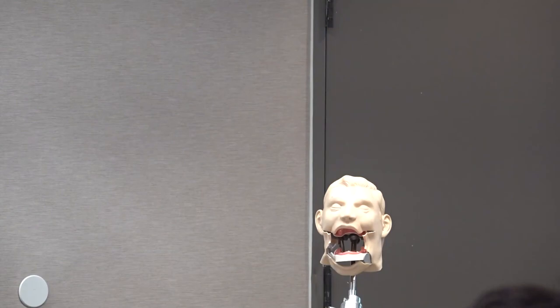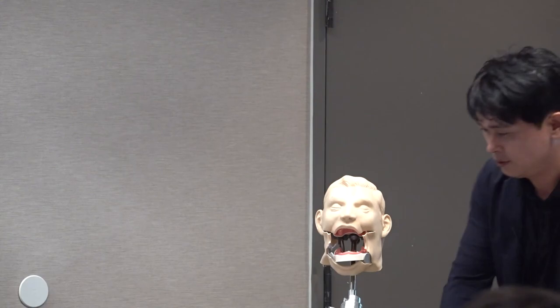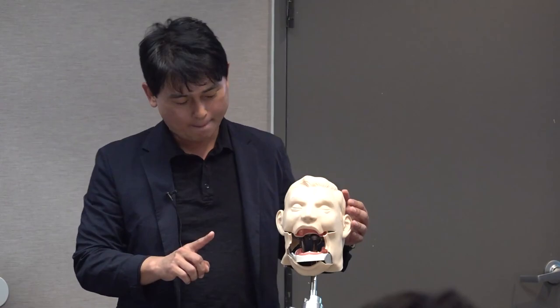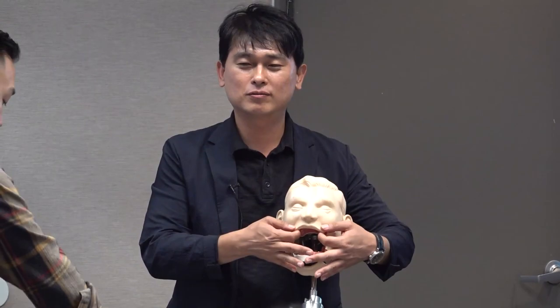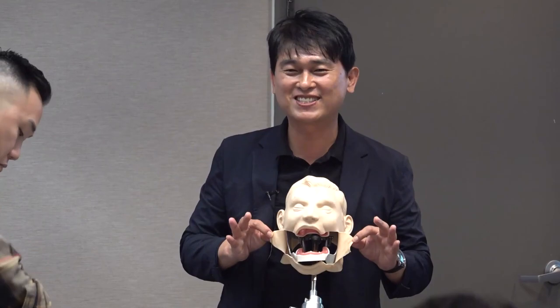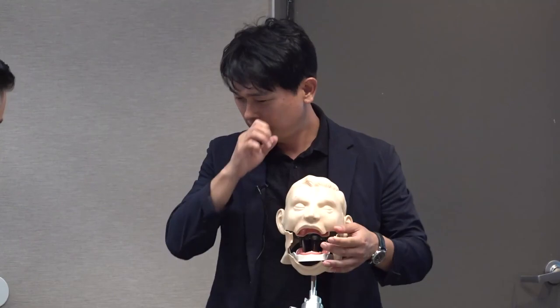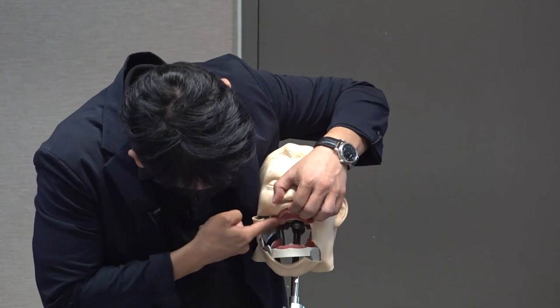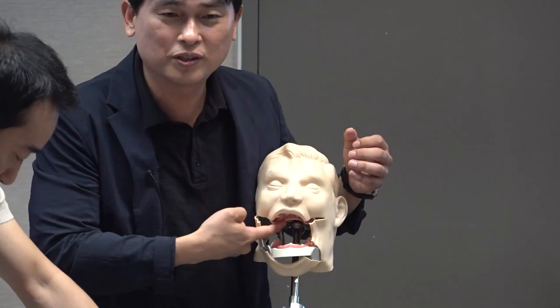Can you help me mixing the body? Help me, please. Do you have Vaseline? Vaseline? The cheek of this mannequin is so sticky, so I cut this cheek like this, I'm sorry. Oh, it's very heavy force. The gum is silicone too, so I have to apply the Vaseline.